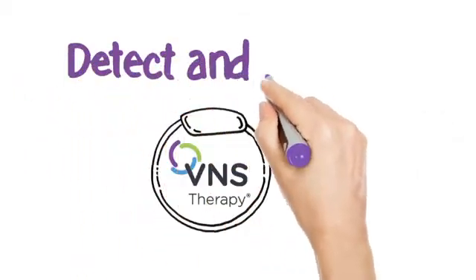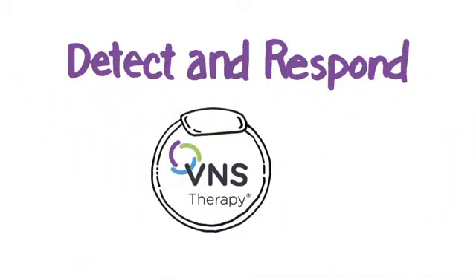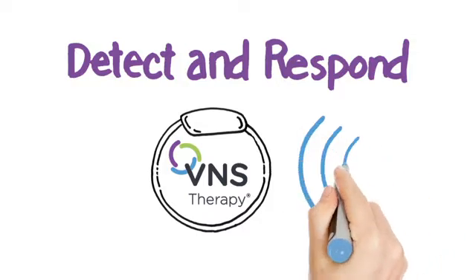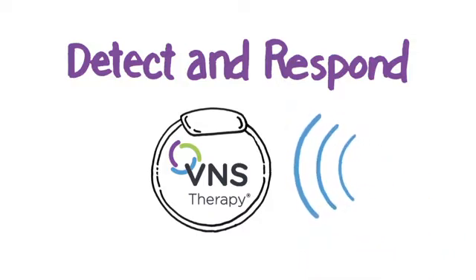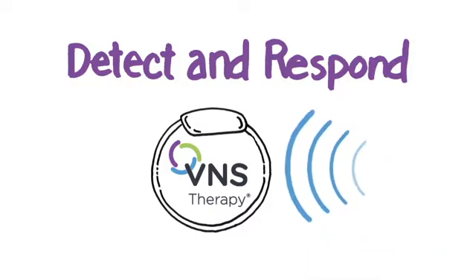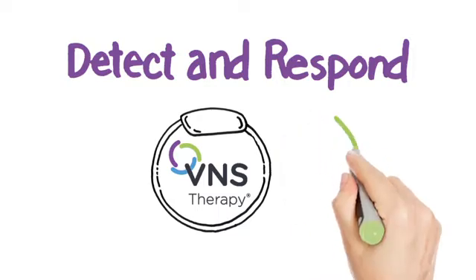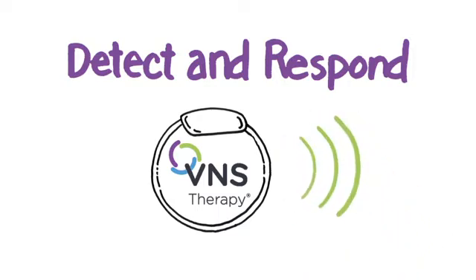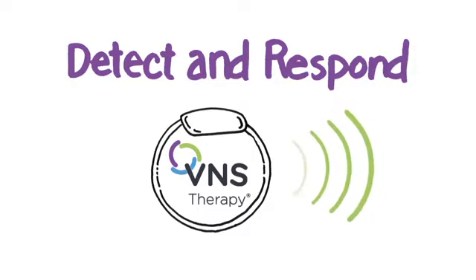First is the detect and respond feature, the latest advancement in VNS therapy. It detects a rapid rise in heart rate, which is often associated with the start of a seizure. The device responds by delivering an extra dose of therapy. In many cases, this can stop a seizure.